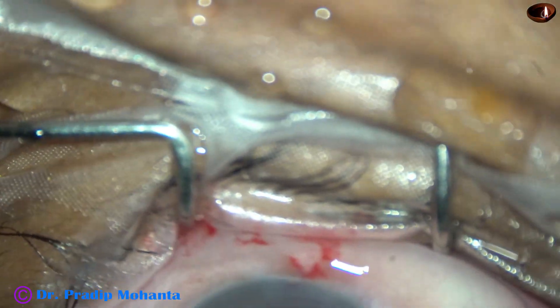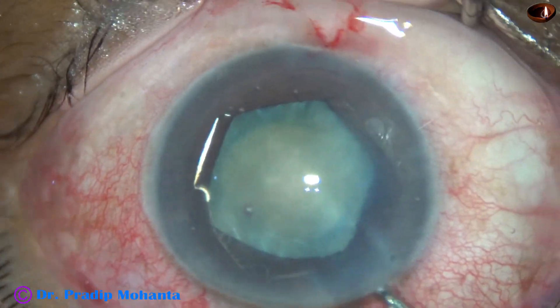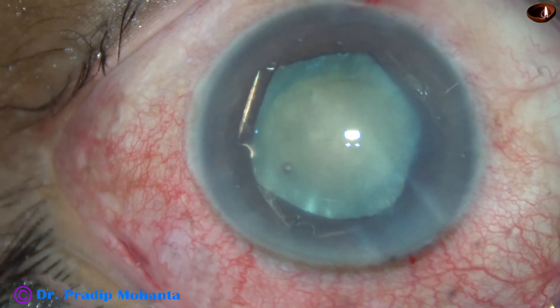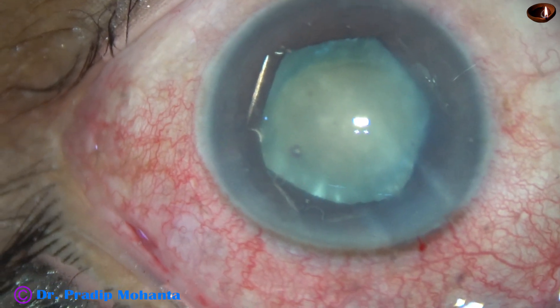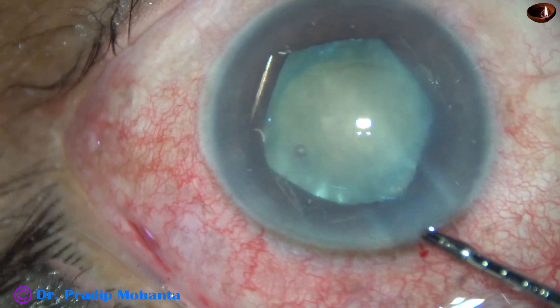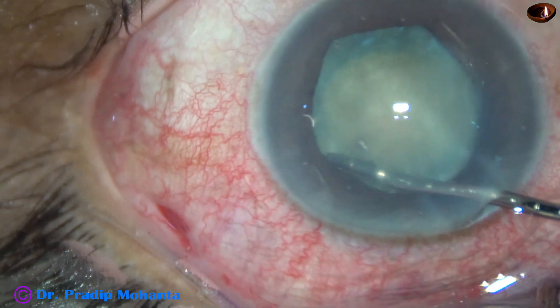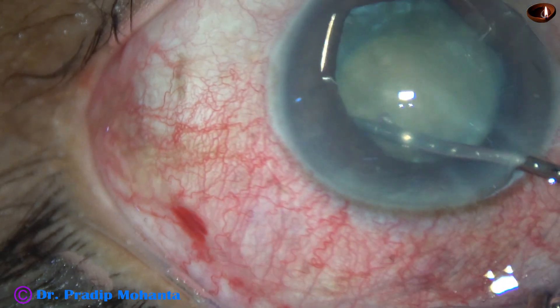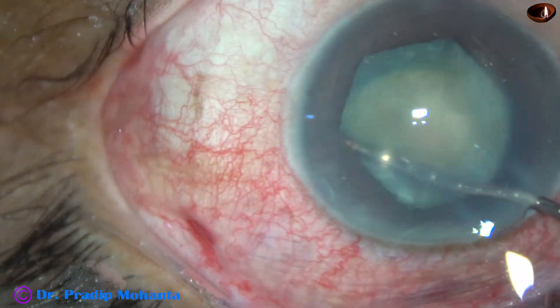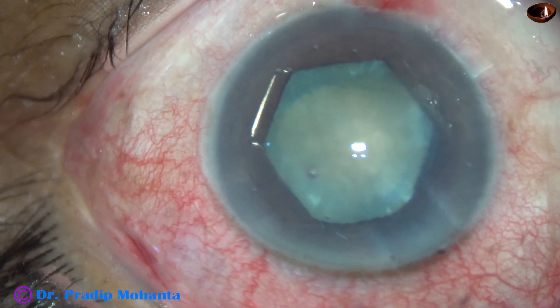I inject some more Visco. I can see that the flange at 10 o'clock — one notch has disengaged. So I hold the middle tab again and place the flange at 10 o'clock. Yes, and now it is done.